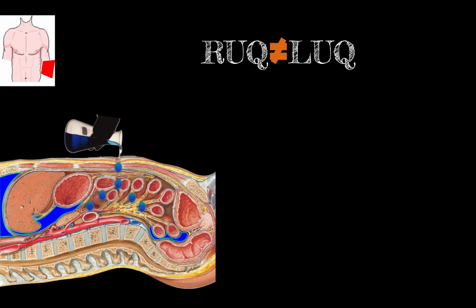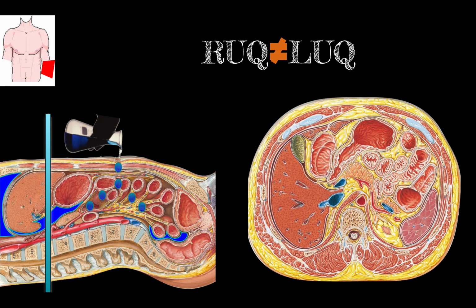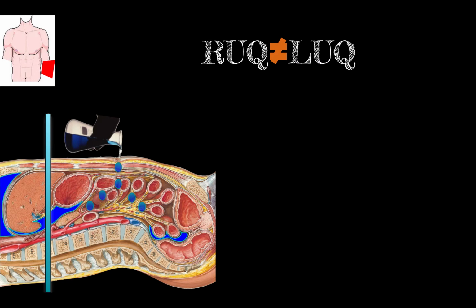Unfortunately, the left upper quadrant has some other differences that you need to be aware of. If you take a transverse slice through the region we're ultrasounding, you'll notice that unlike the right upper quadrant, where the liver is large and gives a very nice acoustic window, the spleen here is much smaller and sits much more posteriorly. If you look at the next rib space up, you'll start also running into a big portion of bowel called the stomach.